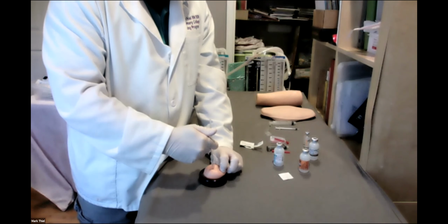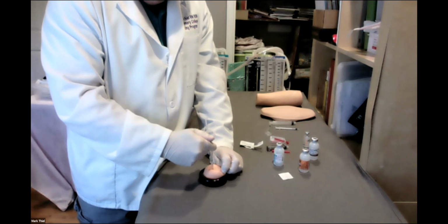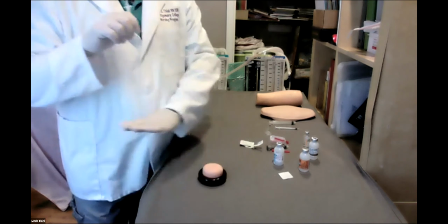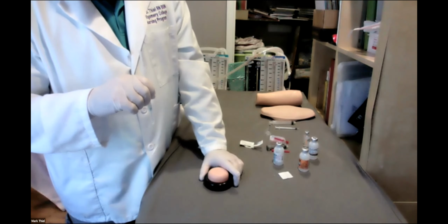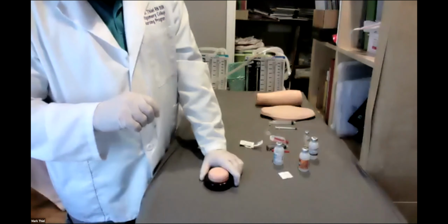Inject slowly. I demonstrated too quickly. Inject slowly. We will be withdrawing the needle and releasing the Z. That's called, again, the Z. When we do that, that's the proper way to administer an IM.